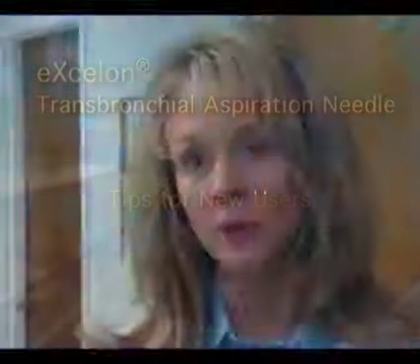I would recommend starting with the subcarinal adenopathy, those who have pathology in the subcarinal region, generally measuring at least 1.5 centimeters or greater, and assuring that these are proximally placed underneath the main carina. I think you'll find that you'll get a satisfactory yield, or more than a highly satisfactory yield, with that type of lesion in the beginning. It'll allow you to become comfortable with the needle and the technique of entering the mucosa safely, and while also making a diagnosis for your patient first and foremost.